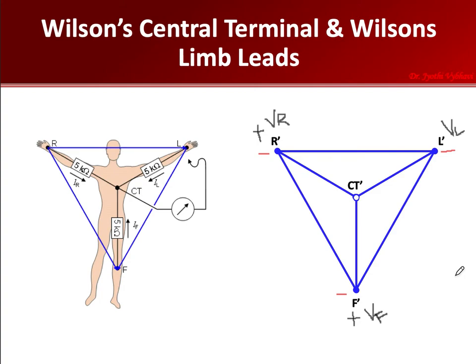So now he could record those areas of the heart which bipolar limb leads could not measure. So all was good. But now there was a problem here. When Wilson recorded after doing all this, the ECG waves which Wilson recorded were very, very small. It was almost unreadable. There was a big problem. So all the scientists said it was not the right method and they didn't want to read this. So we'll see how the Wilson's ECG looked like.